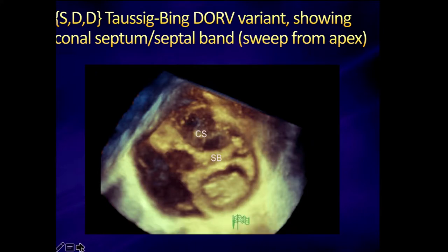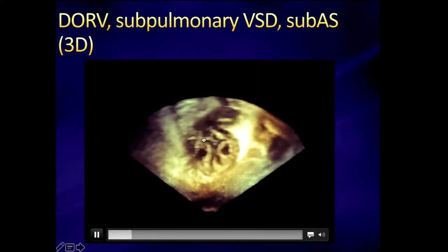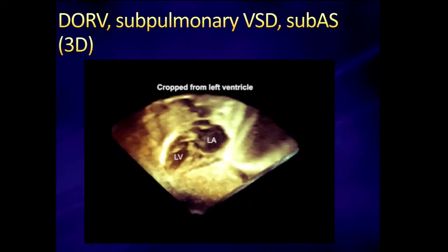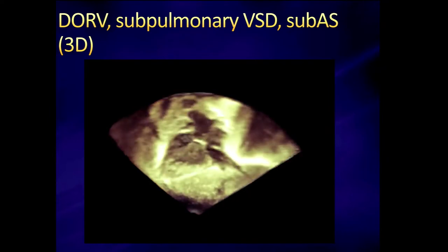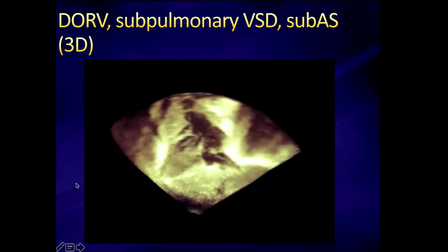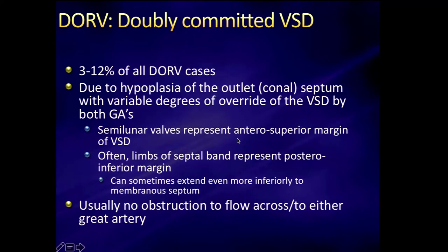This 3D shows how the pulmonary valve overrides, and the conal septum looks like a door just hinged at one side. Since the VSD is aligned with the pulmonary artery, this patient is going to need an arterial switch operation because of significant subaortic stenosis, and may need an aortic arch repair. That's a much different and probably more complicated operation than the previous one, and many of these patients also have coronary artery anomalies.